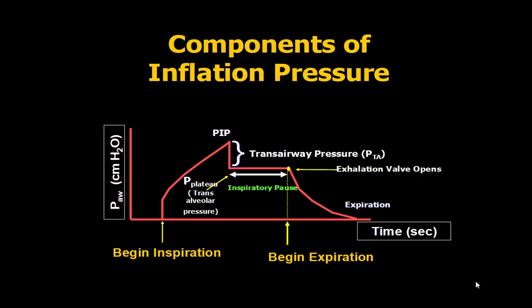So this level is what's called the plateau pressure. So plateau pressure is a time when the alveoli are open and the pressure has disseminated and sort of dispersed into all the alveoli. So that's more of a reflection of your pressures at the level of alveoli. So the plateau pressures are the ones you are really concerned about rather than the peak pressure. Peak pressure goes into the airways, the bronchi, bronchioles and so on. But once it comes into the alveolar level, the plateau pressure makes more of a difference.